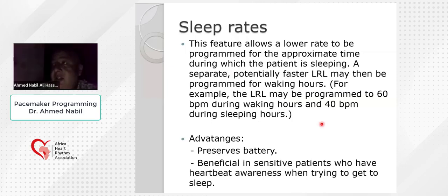Sleep rate, which is an option in many devices, can give the opportunity to adjust two rates for the patient, especially in a single chamber pacemaker in which there is a lower rate limit, for example, adjusted at 70 beats per minute.